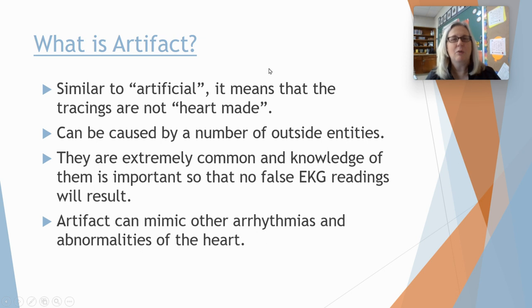Some of them can read kind of like arrhythmias do. We looked at AFib in last class, how there's a lot of wigglies in there. If you're not careful with your lead placement and the patient moving, then it can look like AFib. We don't want to misdiagnose somebody. So we want a nice clean EKG, like the ones I have printed for you. They're nice and clean, it's straight, no wiggles. Artifact comes from the word artificial, just meaning it's not coming from the heart.